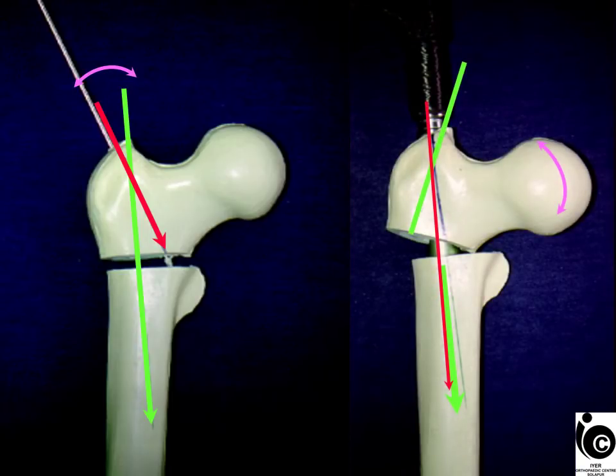So the red line indicates the direction for putting the guide wire for intertrochanteric fracture and the green one for subtrochanteric fracture. But friends, I take the green one for intertrochanteric fracture and I take piriformis fossa for subtrochanteric fracture, and I am not repenting.